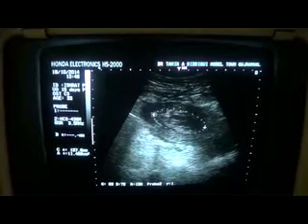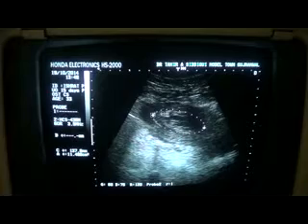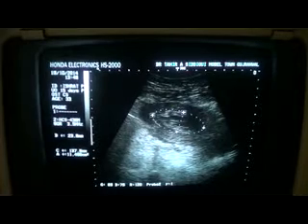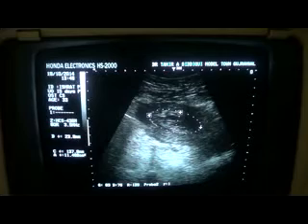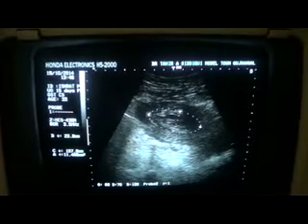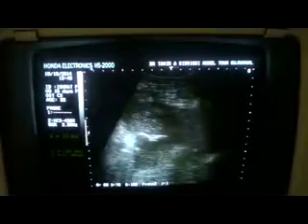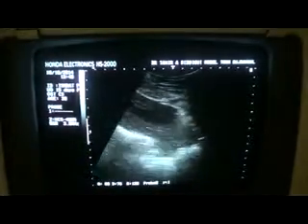This is the endometrial canal, and you can see multiple tiny thread-like structures within it, giving it a layered appearance, and the endometrial canal is dilated up to 2.3 centimeter. Normal should not exceed 1.4 at least 15 days after cesarean section. So this is finding number one in this female.